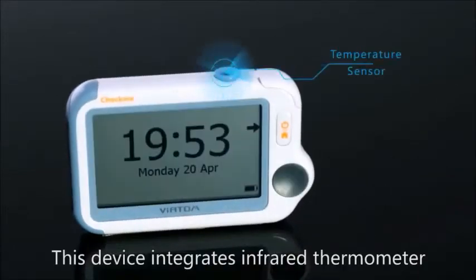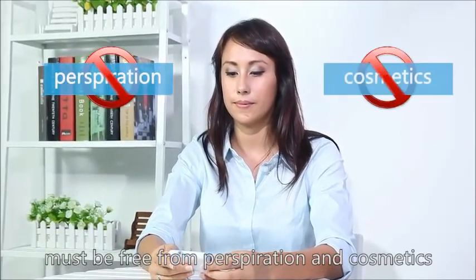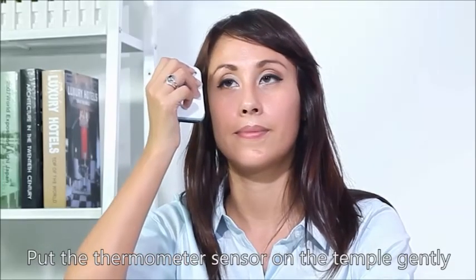This device integrates an infrared thermometer to measure forehead temperature. The forehead and temples must be free from perspiration and cosmetics. On the main screen, select Thermometer. Put the thermometer sensor on the temple gently.